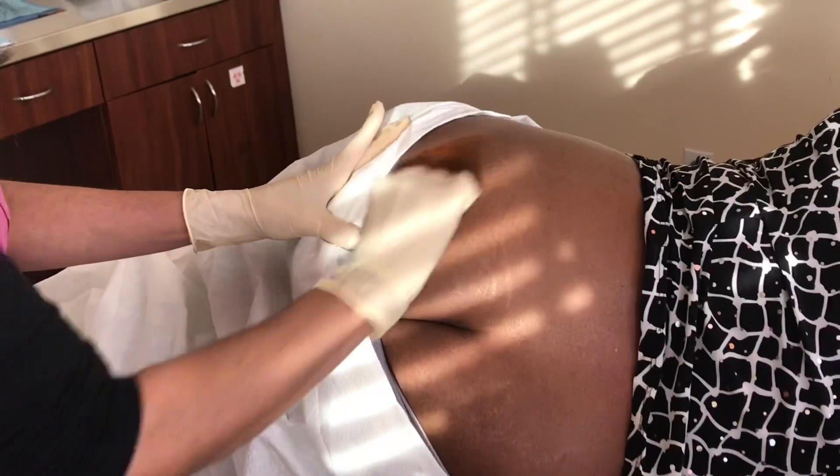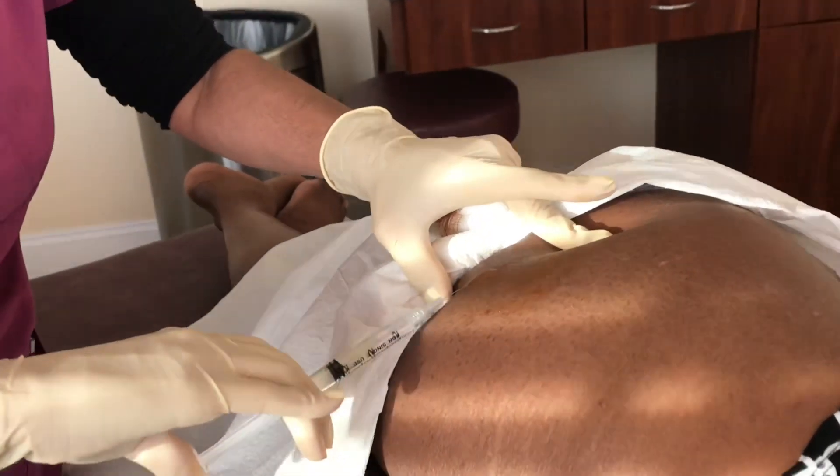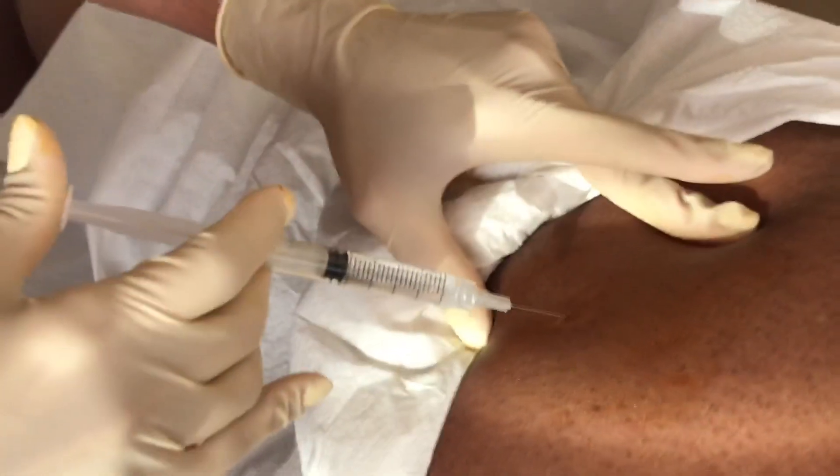Today I'll be teaching how to insert testosterone pellets. First, clean the upper outer quadrant of the buttock hip area with betadine. Then take one to three cc's of lidocaine with or without epinephrine and inject, making sure you see the skin raised.